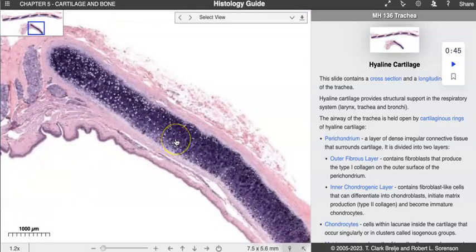And this is the difficult part and the fun part of these tissue slides, where you have your trachea, you have esophagus, because there's so many other things that we can see on that slide. It's not just skeletal muscle. So we start to see this thick pattern here, right? And we know with cartilage, it takes on this kind of watercolor wash background for the matrix, right?